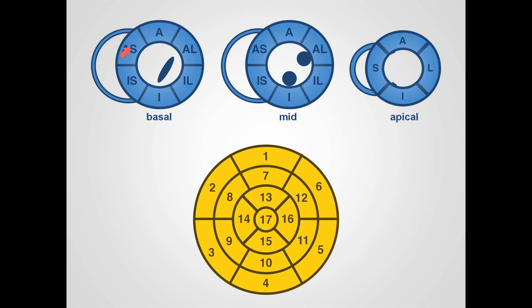The anteroseptal and inferoseptal segments are bounded by the anterior and inferior insertion points of the right ventricle. This is also true at the mid-ventricular level, where again we have six segments named as before. We identify the mid-level by the presence of the papillary muscles. At the apical level, we have four segments: anterior, lateral, inferior and septal. The septal segment is defined by the attachment points of the right ventricle.